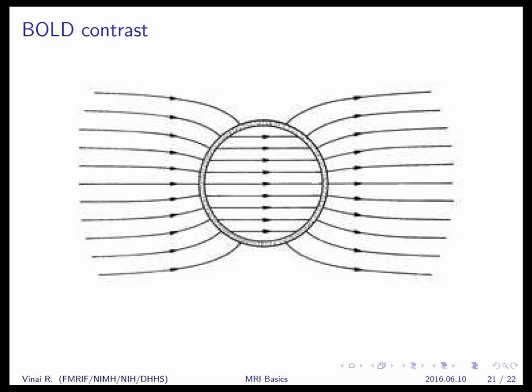Well, the thing is, the reason why this contrast works is you have to give it time for these differences, because remember the video: if you image too early, they're still relatively in phase together. It's only after you wait some time that the differences pop out. So just to explain, let's say this whole thing is surrounded by a big voxel, and all your spins are in it.